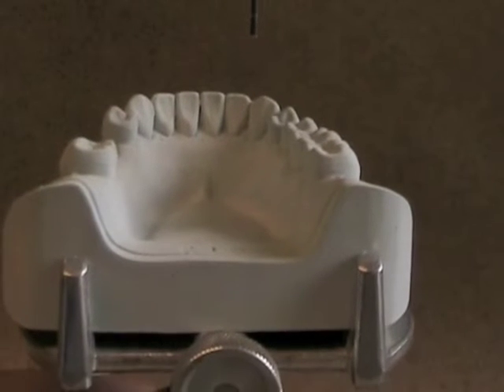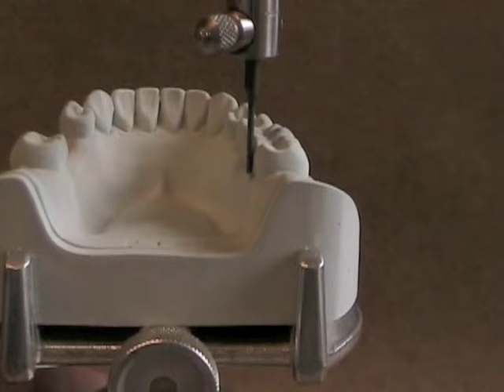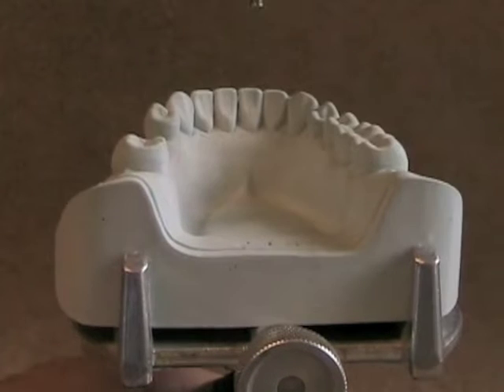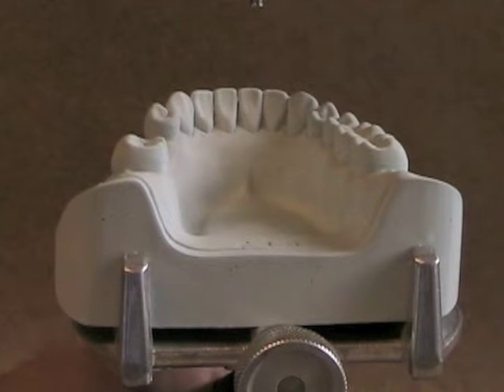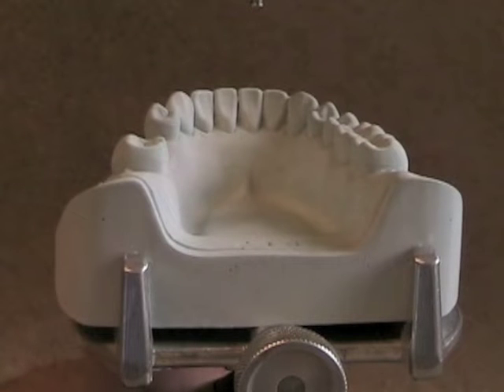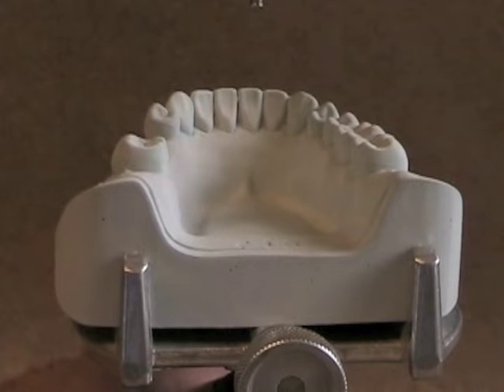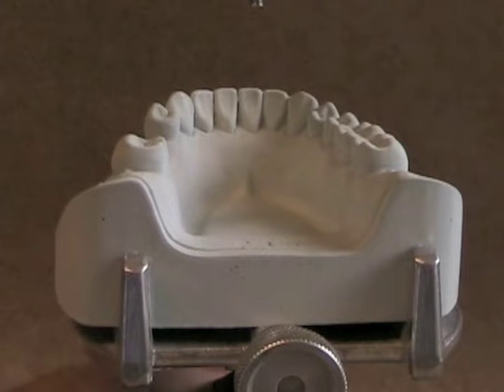We'll also check on the lingual surface. We want to make sure that the undercuts we see on the lingual surface in the fourth quadrant are similar to those on the lingual surface of the third quadrant. When we've equalized our undercuts, we want to check for a retentive undercut to place the retentive tip of the retentive clasp of the partial denture. Putting that little flexible piece of metal into an undercut will actually help improve our retention — that's what gives the partial denture its retention, along with some other factors.